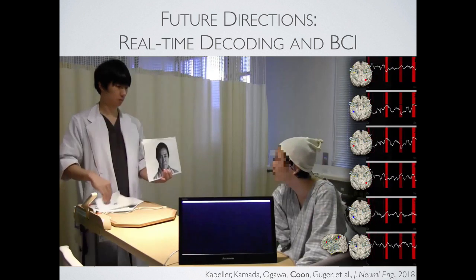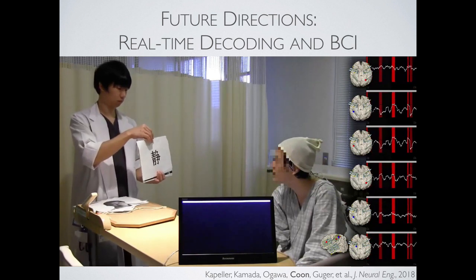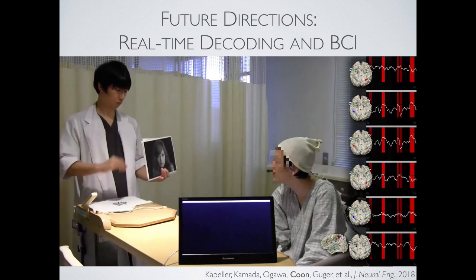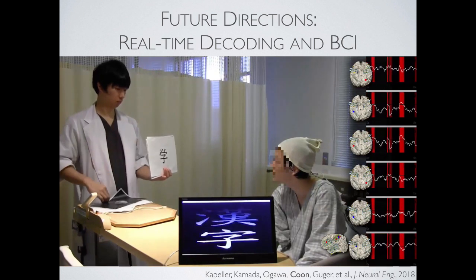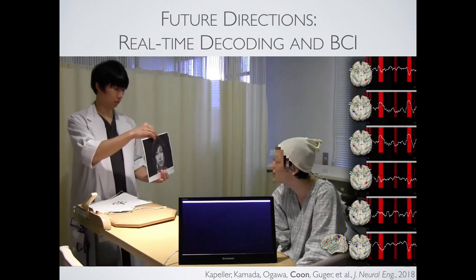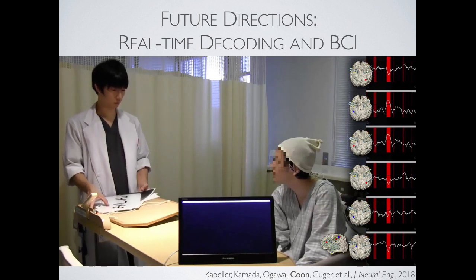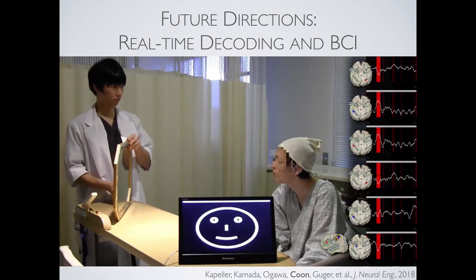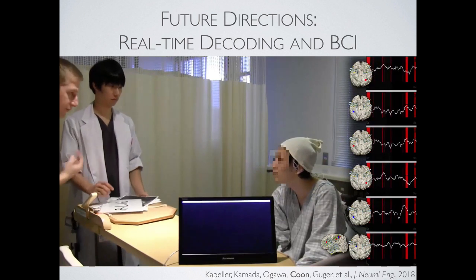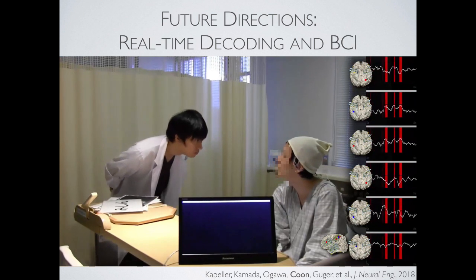So you can see that it works fairly well with pictures. The experimenter is going to show him his face, so we know it's not just photographs. It works in a mirror, and it works with an unfamiliar experimenter. That's Dr. Capella there.